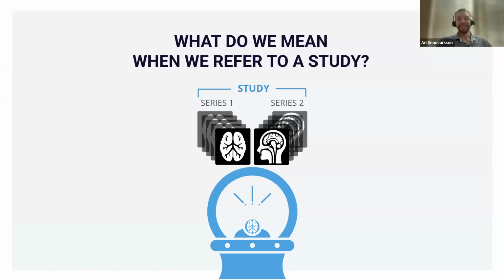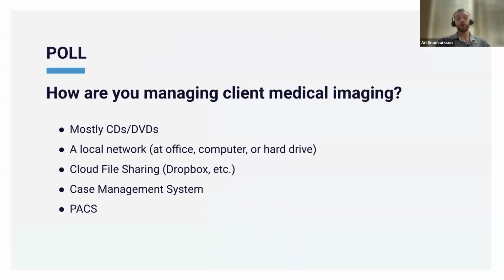It's true. So in line with that, we have a poll that will be coming up asking about how you are currently managing your medical imaging in your firm. A few of the options here are mostly on CDs or DVDs, through a local network like your office computer hard drive, through a cloud file sharing program like Dropbox, through your case management system, or on a PACS. So if you could answer that, we're going to be very interested to see what the audience is currently doing.